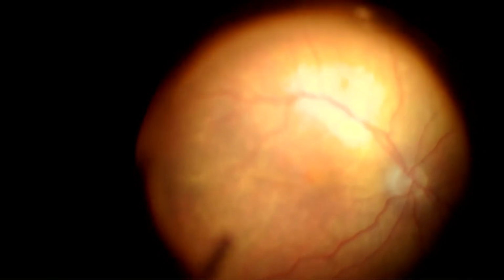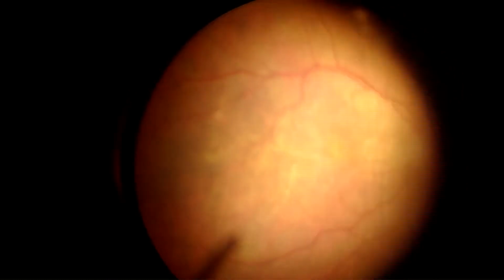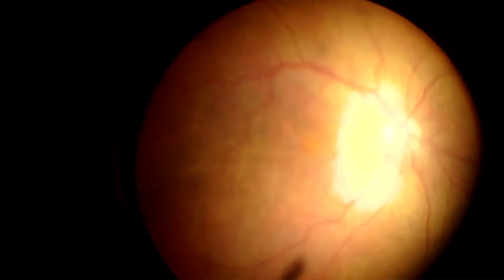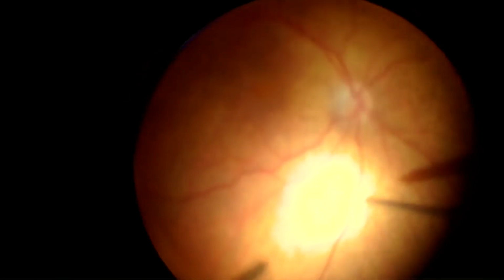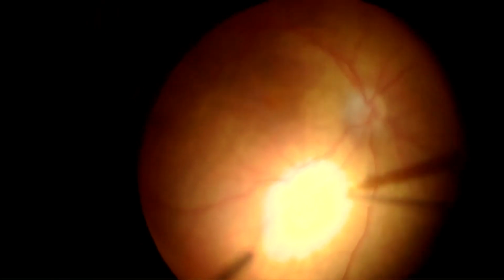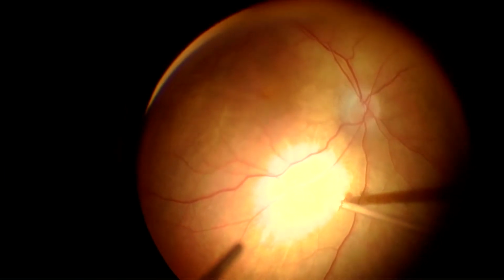The autologous retinal transplant is placed epi-intraretinally, whereas only in the chronic retinal detachment with big macular hole has it been placed under the retina. The same kind of approach subretinally has also been published by Rizzo, but using not retina but autologous amniotic membrane. So today we are trying with the retinal transplant. So far we still don't have approval for use of intraocular amniotic membrane.